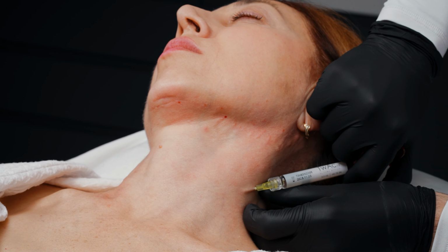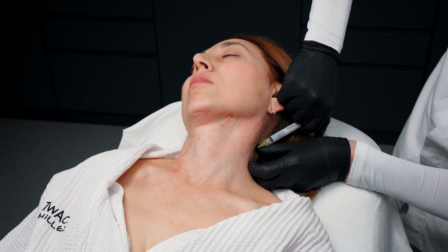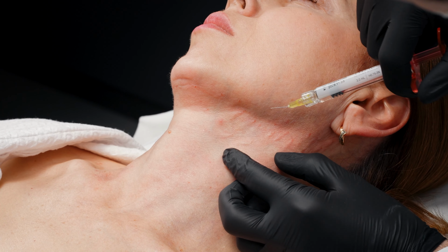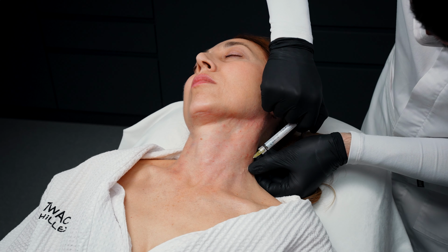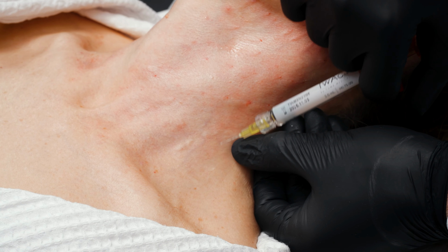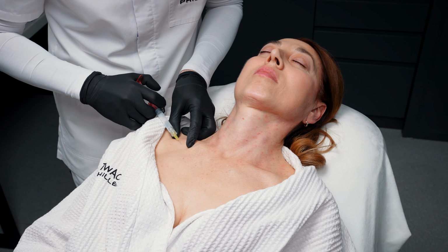Application of TwAc 2.0 in the neck and decollete areas. Inject 3 ml of TwAc 2.0 once every 14 days, with a standard course of 2 to 3 sessions. It is recommended to repeat the course after 6 months.